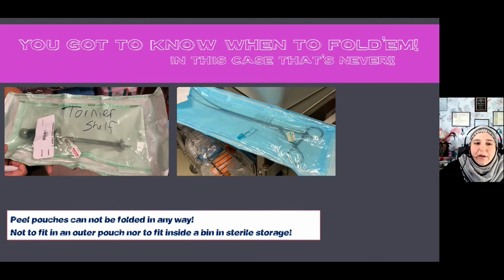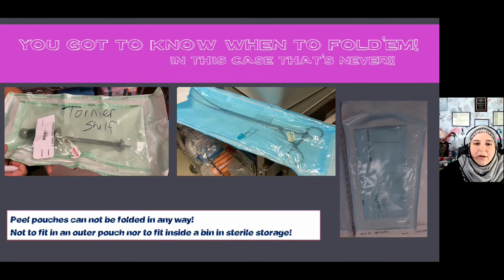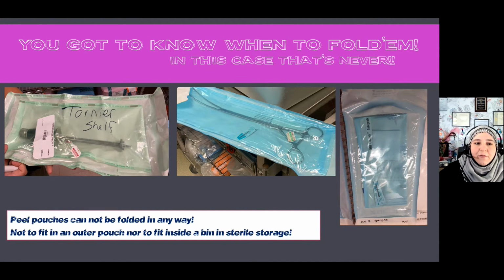So you got to know when to fold them. And in this case, that means never. Do not fold, period. Folding peel pouches to fit inside another peel pouch should never happen. Also, folding a peel pouch to fit into a sterile storage bin or onto a shelf is also something that should not happen.